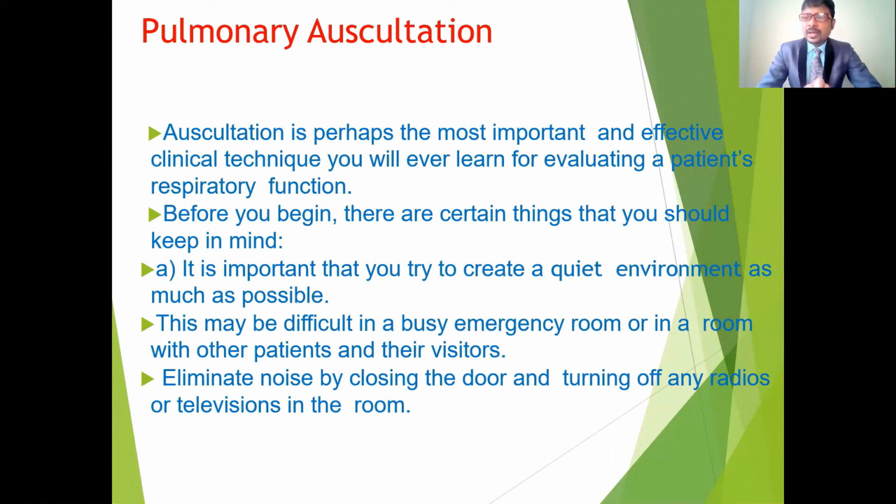Before checking the lung sounds, we have to know the important points and also the do's and don'ts. We have to know about the auscultation of the lung. This auscultation is perhaps the most important and effective clinical technique you will ever learn for evaluating the patient's respiratory function. With this device, we are going to assess and evaluate the patient's respiratory system. And before we begin, there are certain things you should keep in mind.